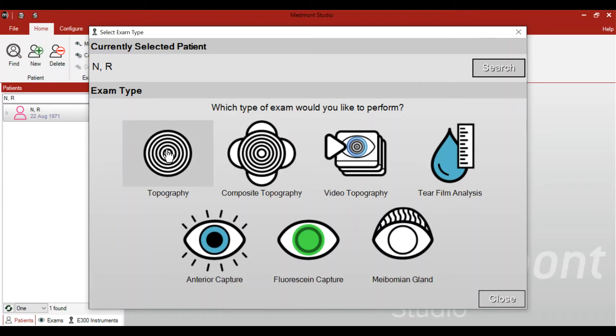The standard capture you might do is the corneal topography capture. This gives you a large view of the cornea and is good for doing screening topographies of the eye — is it regular, is it irregular, is it diseased, is it post-surgical? Any of these questions can be answered by the single topography capture.